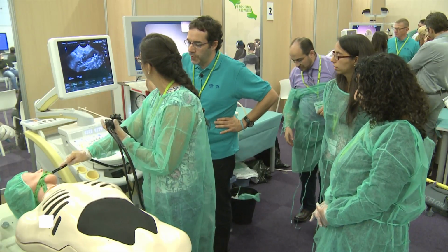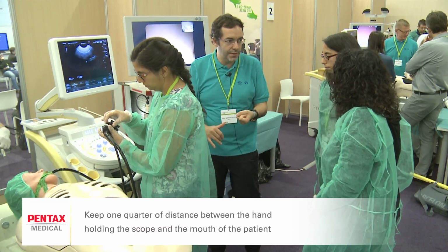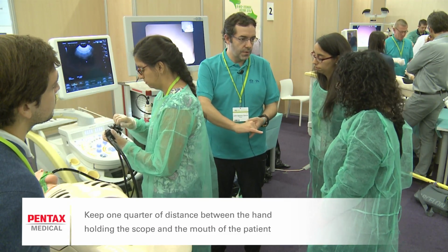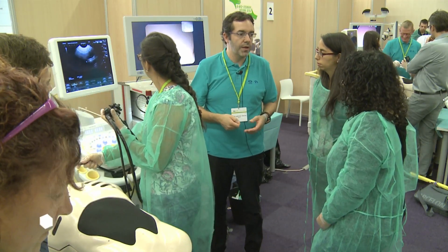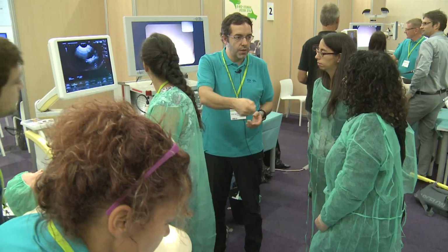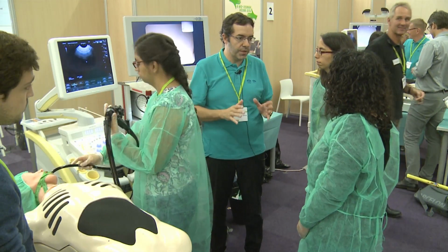There's another trick for EUS, and these are just tricks for EUS: the distance between your hand and the mouth should be about a quarter, because that gives you the space to go to and fro with the scope and really manage the scope properly. If your hand is too close to the mouth of the patient, it's going to make your life more complex.